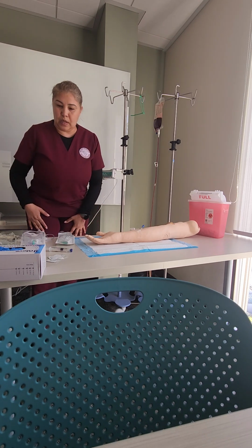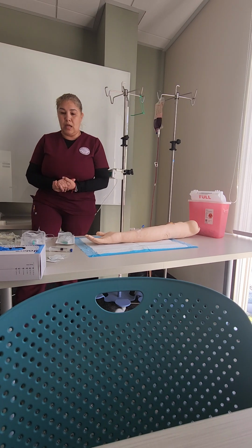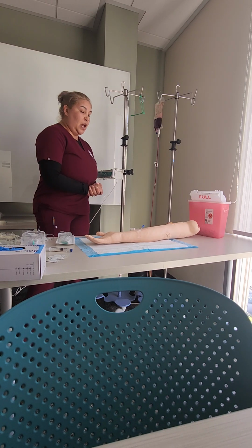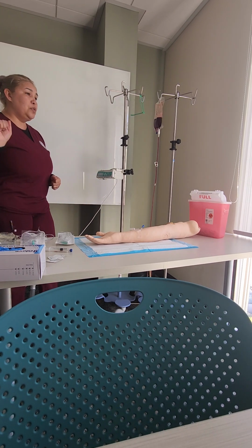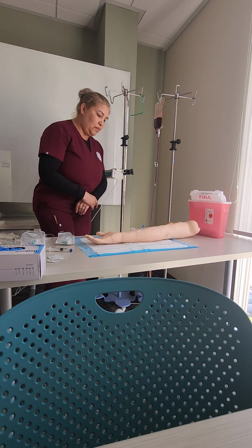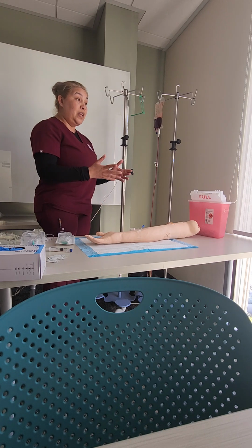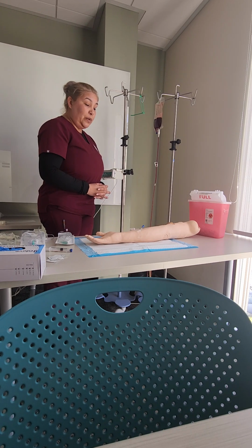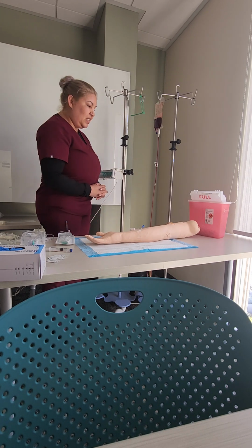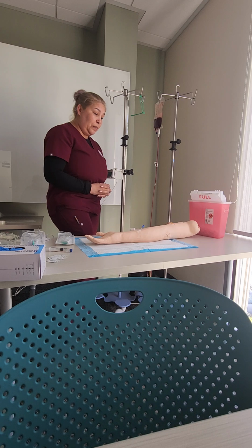Okay, so I will come into the room after I have done all my checks. I knock on the door and perform hand hygiene. Hello, Ms. Smith, I am back. Sylvia again. I placed your IV earlier. Now I'm going to hang your fluids and your antibiotic. Looks like you have an infection going on, right? And you're also a little dehydrated, like the doctor explained to you.